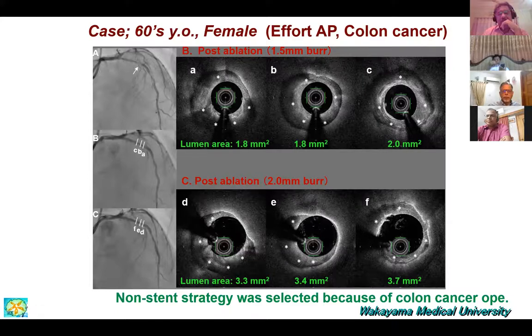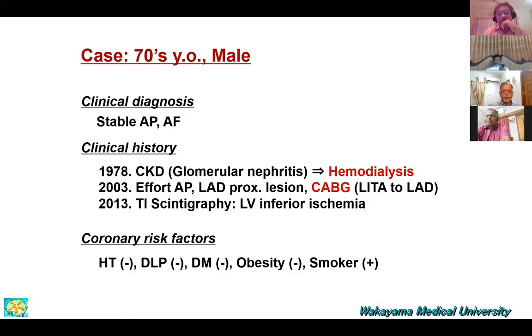And colon cancer surgery is planned after the intervention. Therefore, we did a drug-coated balloon alone, and the patient was in a very good condition. And also, after the operation, the patient is good.